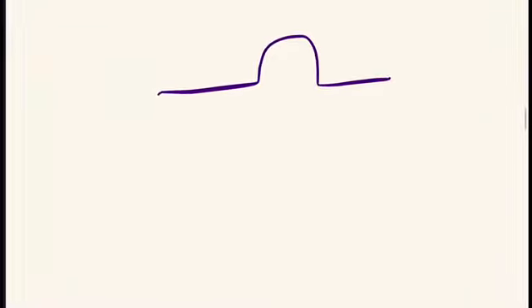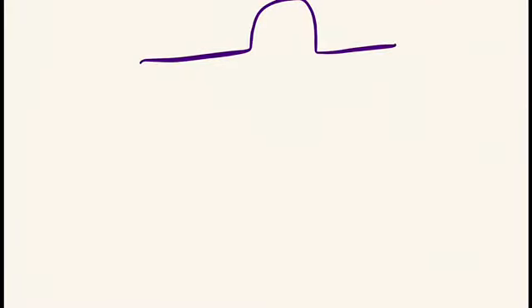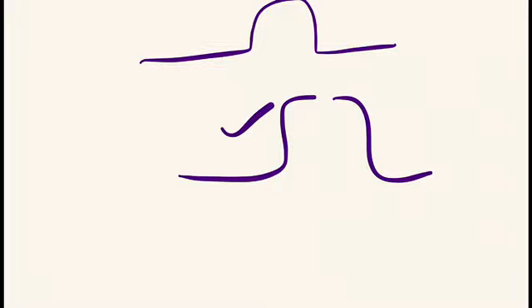Okay, so the P wave is the resultant vector of the depolarization vector from the right and left atrium. Now the right atrium and left atrium will influence the P wave. Any changes in the right atrium and left atrium will influence the P wave. Now there are two parts of the P wave. We can divide this in two parts, this and this. The first part is because of the right atrium, the second part is because of the left atrium.